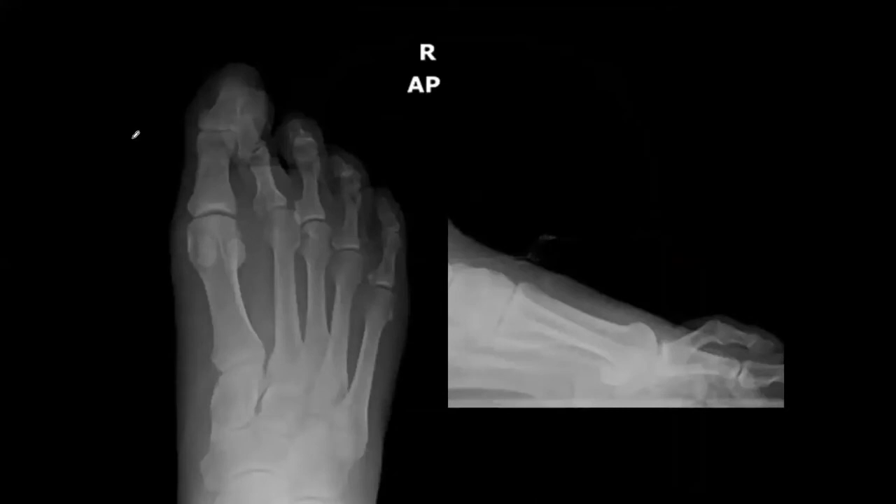Who wants to describe this one? We have two views of the right foot. The second MPJ looks subluxed medially, and on the lateral view there's a dorsal contracture at the level of the MPJ. You can combine your reads: these are two views of the right foot with a dorsal medially contracted second toe at the MPJ. That way you're using all the information from both views.